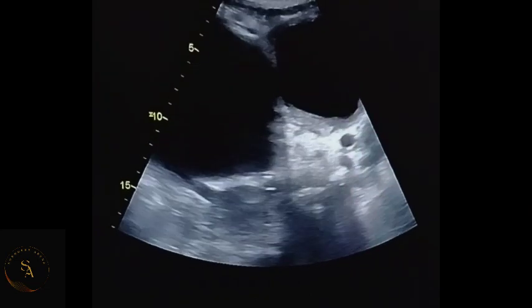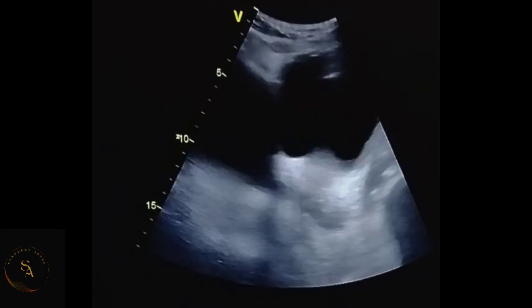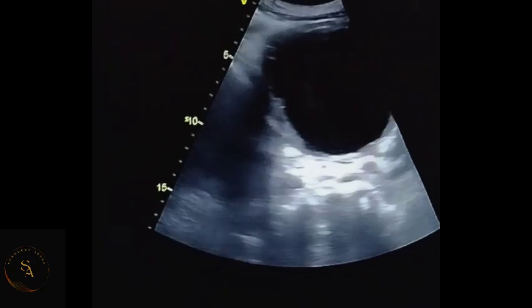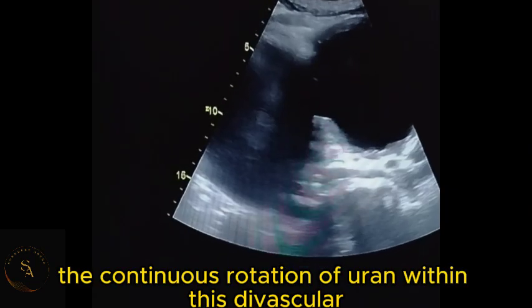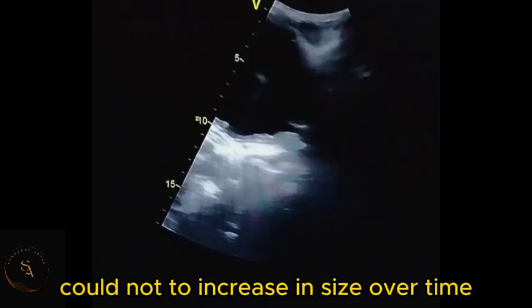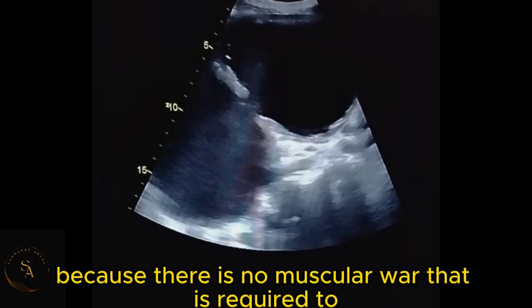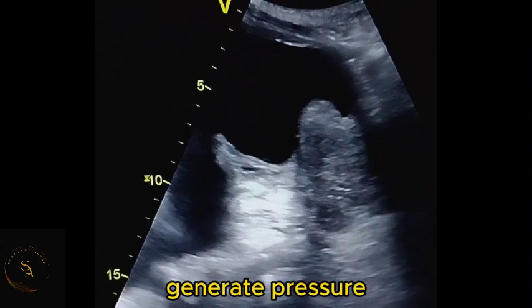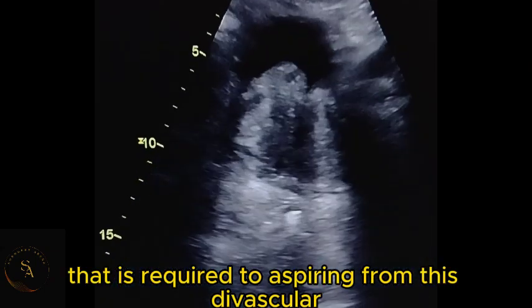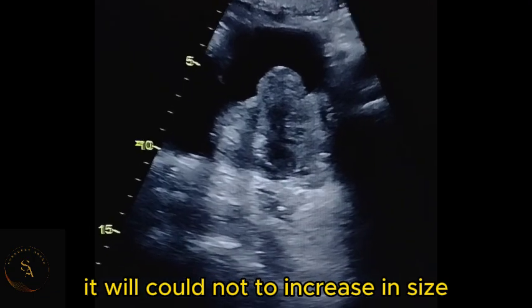Unlike the urinary bladder, the diverticulum has no muscular wall. This will lead to the continuous retention of urine within this diverticulum, and this will make the diverticulum continue to increase in size over time. Because there is no muscular wall that is required to generate pressure to expel urine from this diverticulum, it will continue to increase in size.